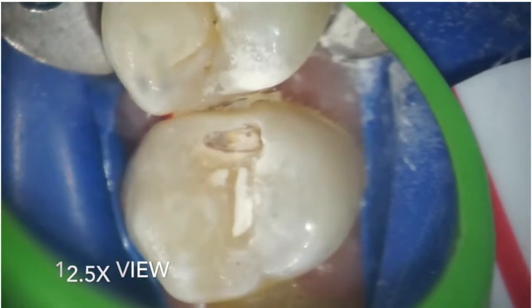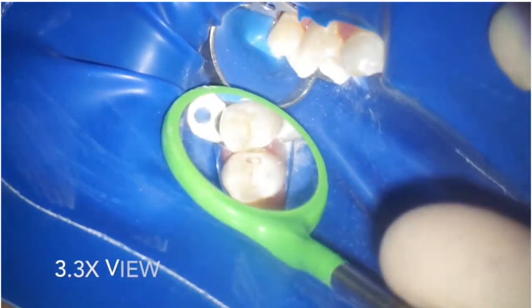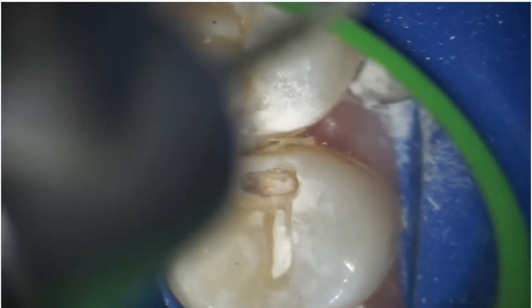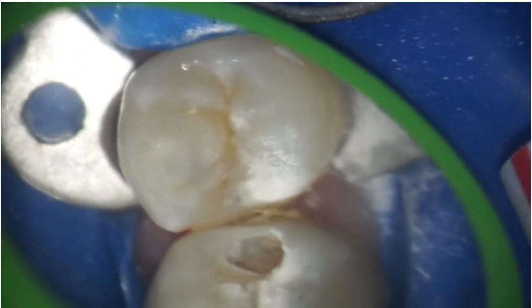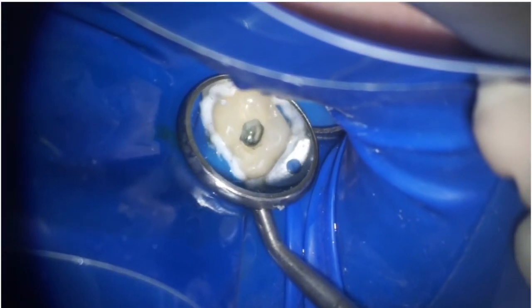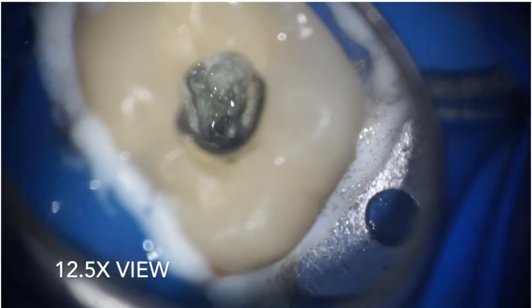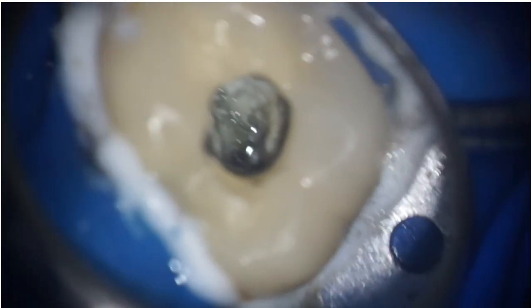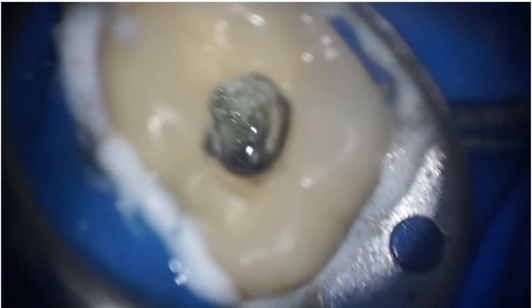Here we are at 12.5 power magnification. We can easily go to 3.3 and back to 12 without moving the mirror, without taking our eyes out of the oculars, and without putting down the handpiece. With endo, we can go from 3.3 power to 12.5 power. Imagine trying to do that with loops. This Seiler microscope has six different magnification lenses that go from 3.3 up to 21.